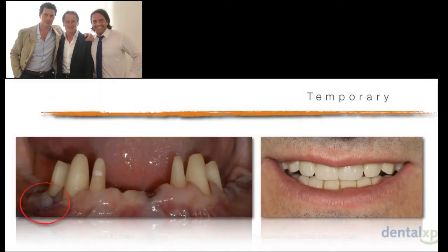And 48 hours after, when the patient comes to our office again, we prepare the tooth with a knife edge finishing line, in order to be more conservative, in order to have more tooth support. We do, if there is the need, mucogingival surgery and osteo resective surgery on tooth number 44 that we saw from our treatment plan evaluation that needed it.